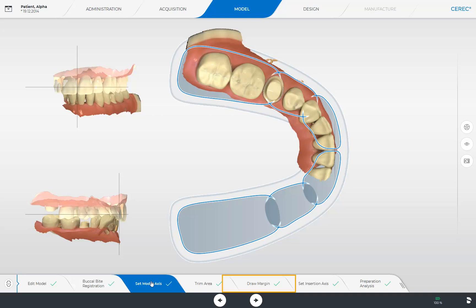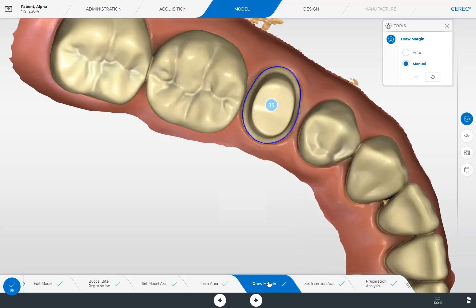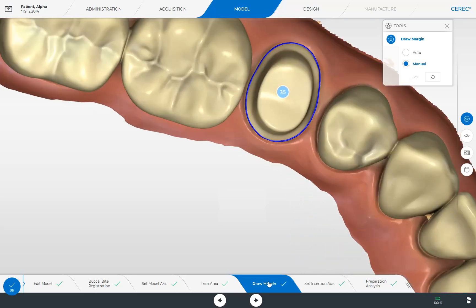We go back to the step Draw Margin. We could edit the automatically determined preparation margin with the help of the tools if needed. Since this was also ideally defined, we switch to the next phase, the design phase.